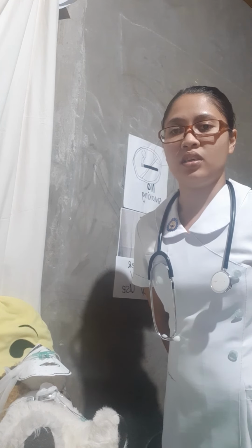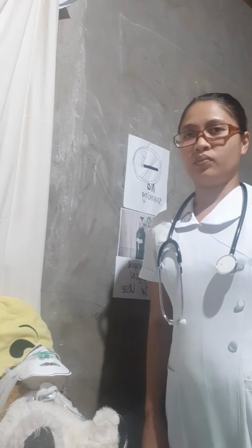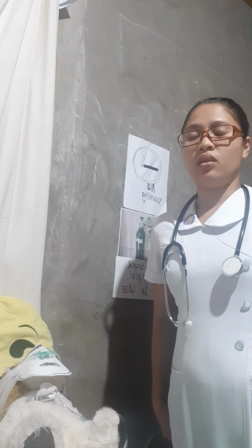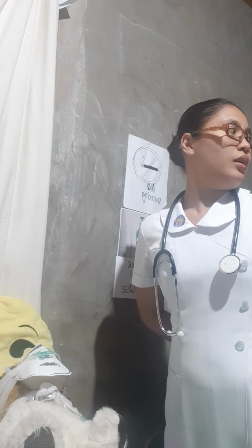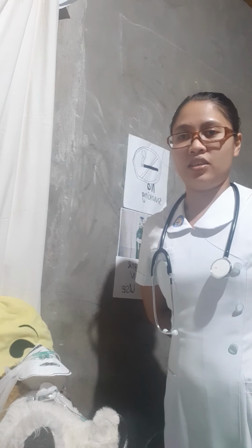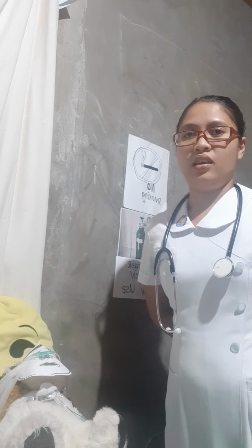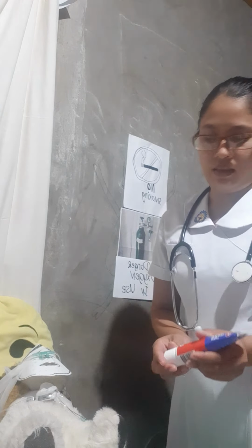Next, for a post-operative patient, we need to administer pain medication before the suctioning. Also, we need to explain to the client what we are going to do and why, and reassure the client that if he feels any difficulty of breathing, he or she can interrupt me during the procedure. Then next, we need to perform hand hygiene.